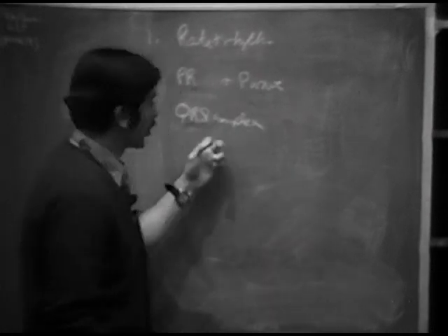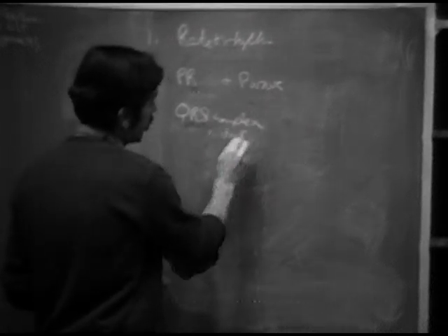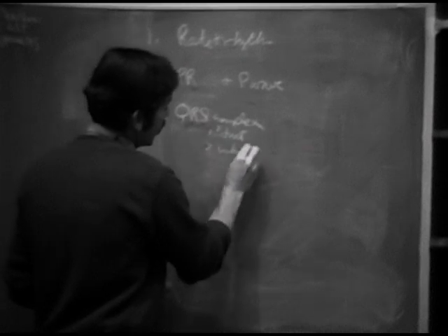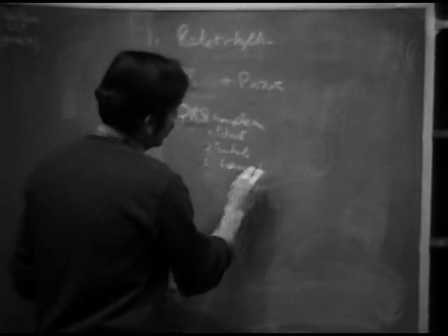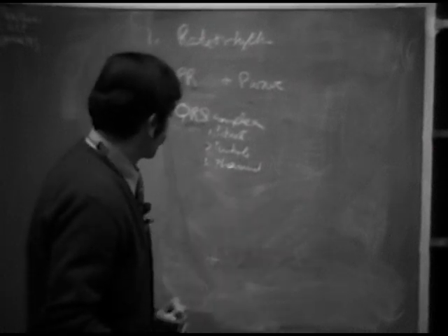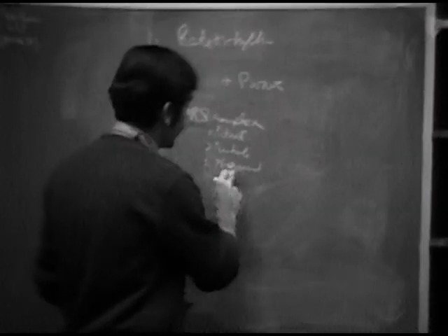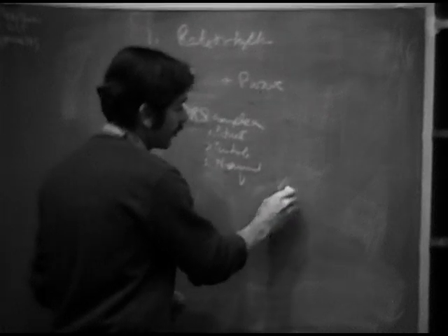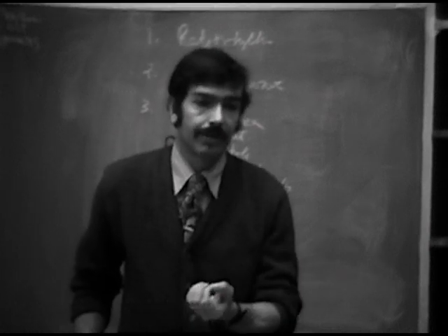Okay. So then you look at V1 and V6. Maybe I should write this down. You look at the initial, the whole thing, or the terminal. Initial, whole, or terminal conduction disturbance. Decide which you're dealing with. And if you're dealing with a bundle branch block or terminal conduction disturbance, then you look at V1 and V6, as we described, and decide whether you're dealing with a right or a left bundle branch block.